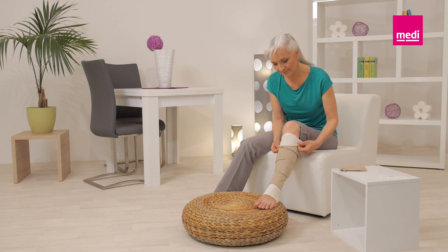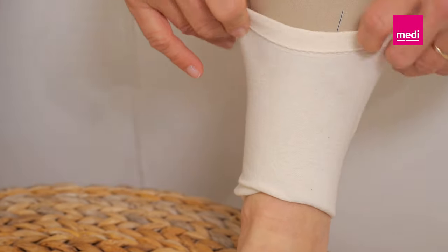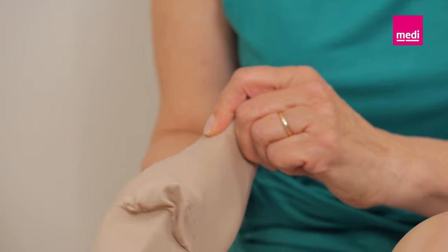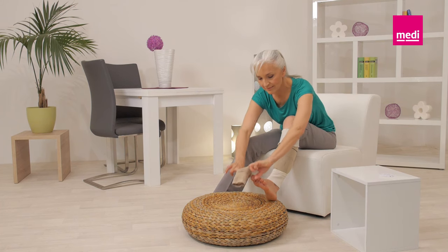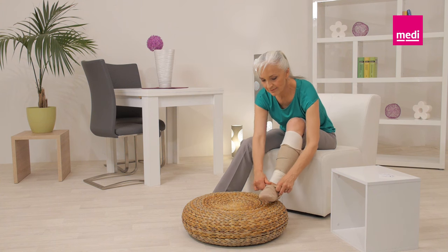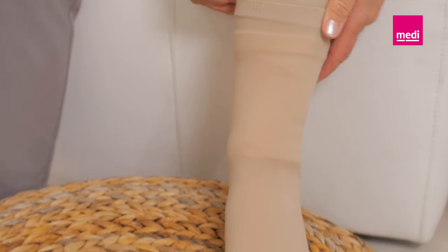Once the correct pressure is set using the BPS card, you may fold the top and bottom part of the circade undersleeve over the top and bottom edge of the circade juxtalite garment. For an easier application, slide your hand into the circade compression anklet and turn it inside out, just up to the heel. Slide the circade compression anklet onto the foot and ensure that it is pulled high enough so that it overlaps with the circade juxtalite. Ensure that there are no wrinkles in the anklet or the undersleeve.